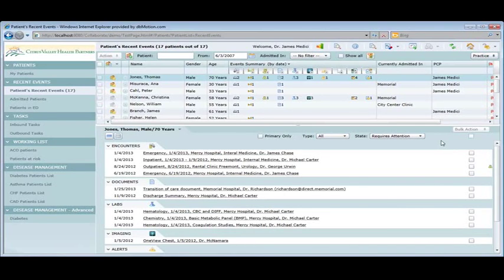There's another question: is there a published list of EMRs that are publishing the data? Is there a list of other EMRs that we have already worked with, that we actively have clients receiving data from? The answer is yes, and I could get that to you offline. On the surface, if you name one, we've probably worked with them.